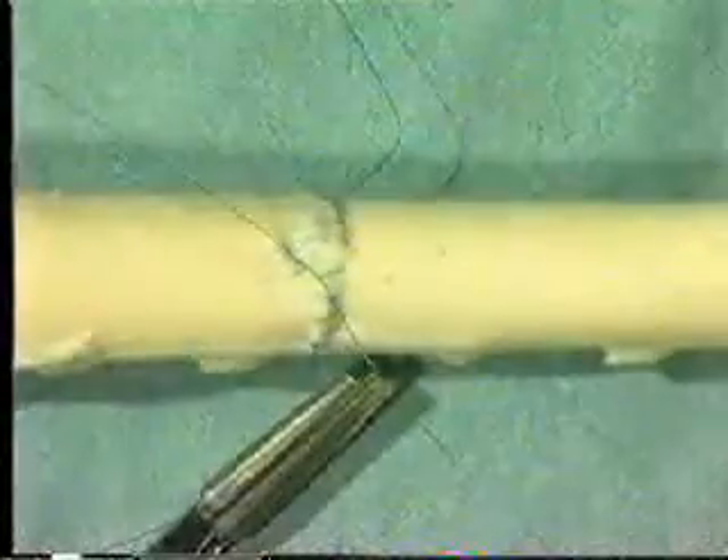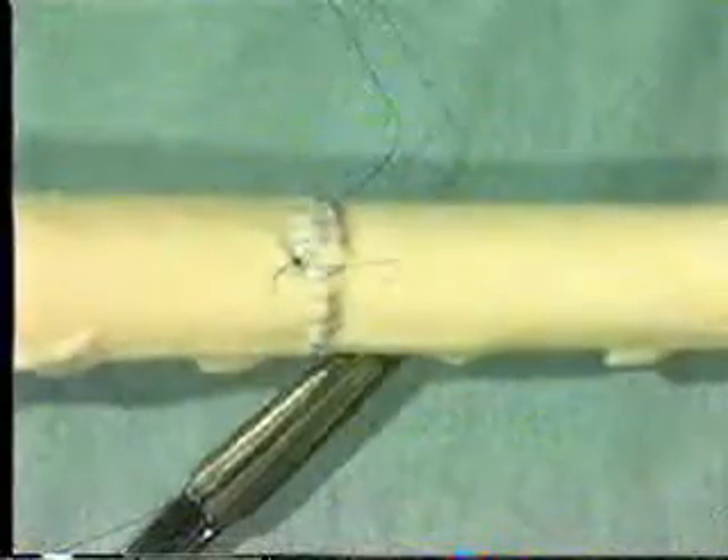Once the apex has been reached, the two sutures may be ligated. Having flushed the inflow and outflow vessels to get rid of air and thrombus, several throws of a well-formulated reef knot are required before the suture material may be cut. The completed arteriotomy can now be seen with no stenosis.